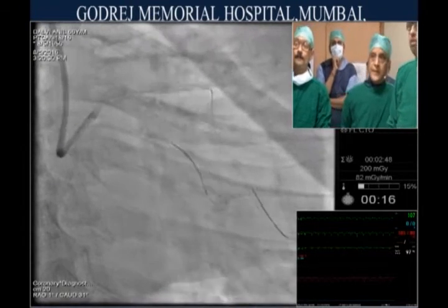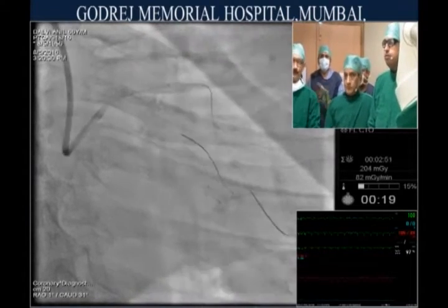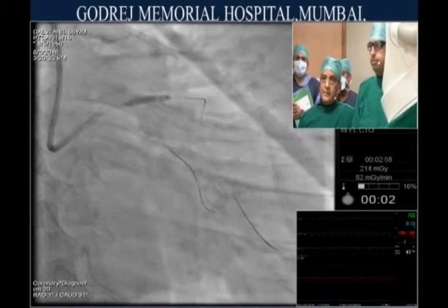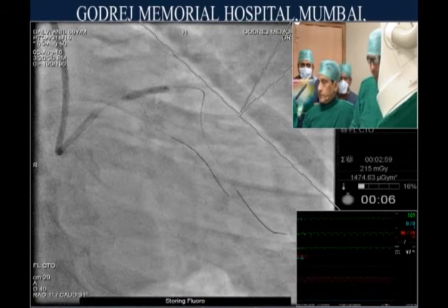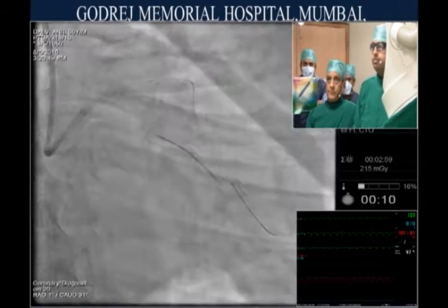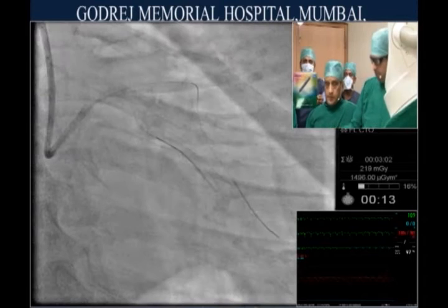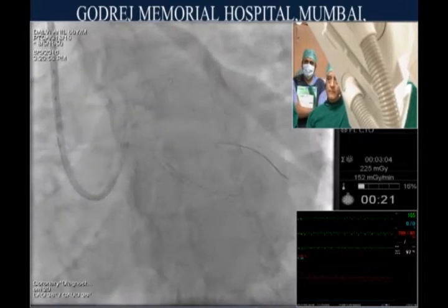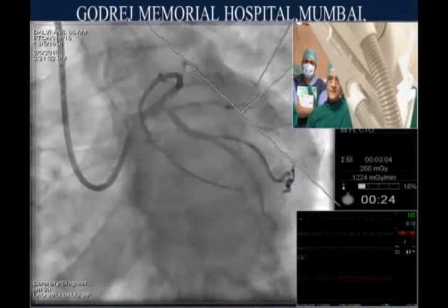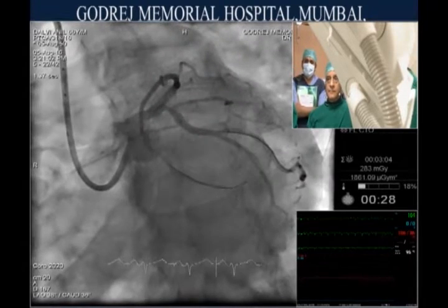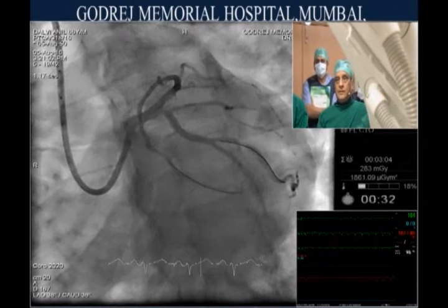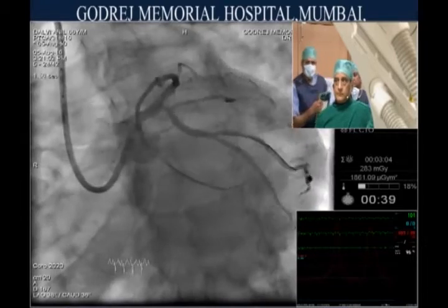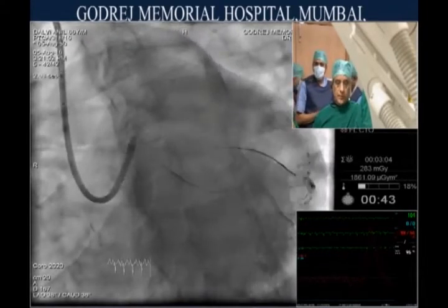After dilating the LAD, we'll take a left caudal view. We can see the circumflex ostium. Although it's a moderate lesion, I would favor treating it afterwards if needed. If we can get away with a one-stent technique, that would be best.